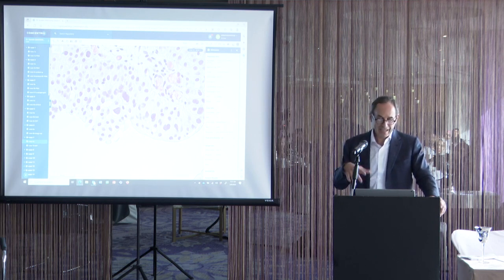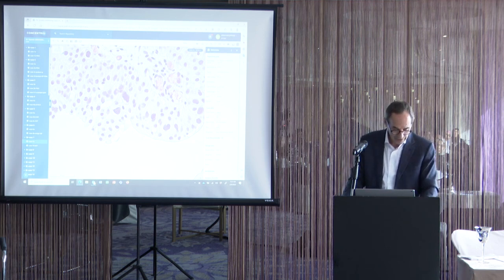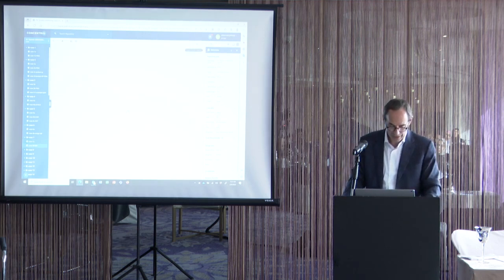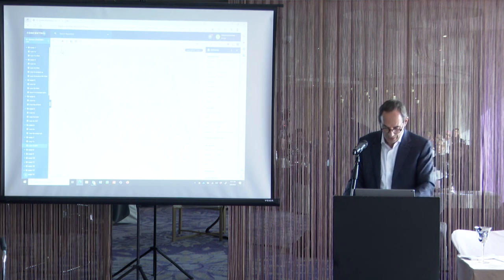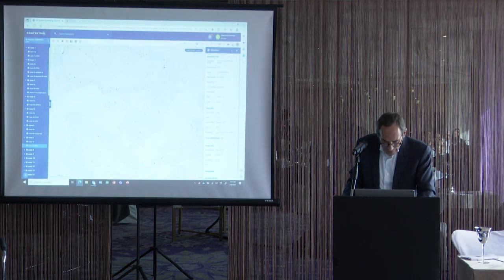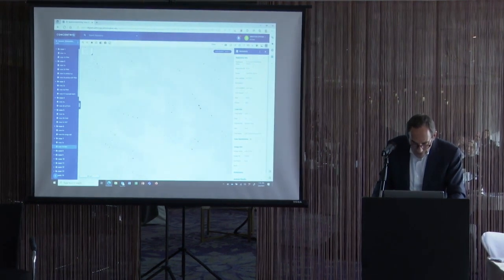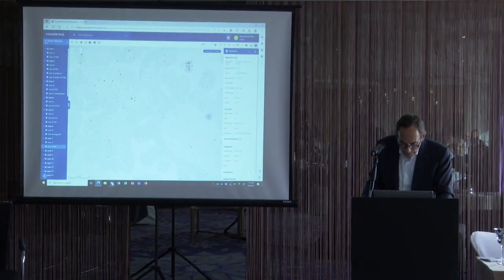If you were looking for mitotic figures, you wouldn't find any here, hardly any. If you did a Ki-67, which I don't routinely do in papillary tumors, but in this case I might, let's actually look. So now you do a Ki-67, you say, okay, this is a tumor with all these big cells. Those big cells should be very highly proliferative.